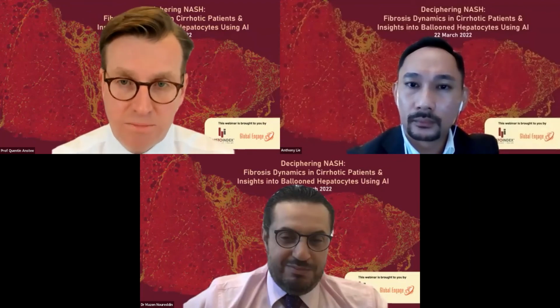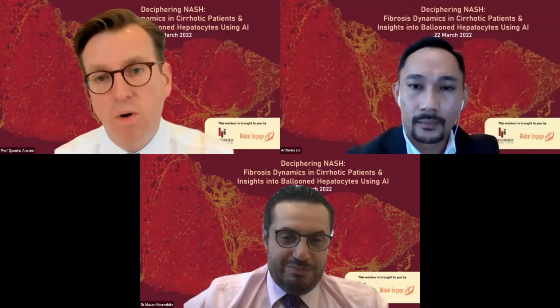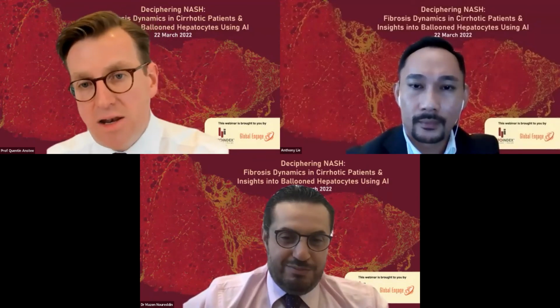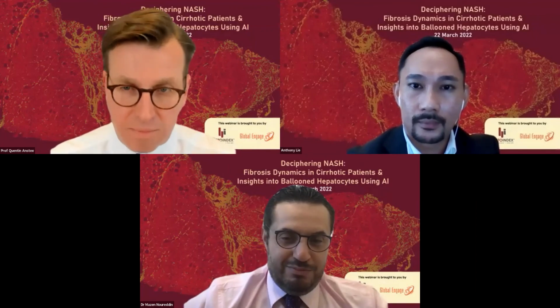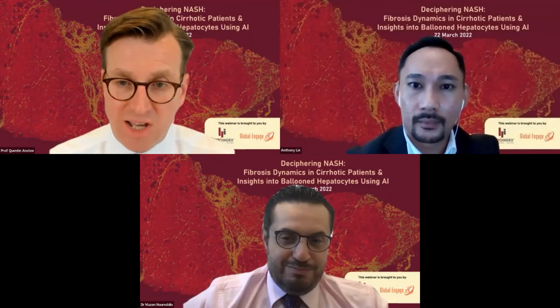So the pathologist examines a biopsy, confirms that it is the right disease, not autoimmune hepatitis, not viral hepatitis, and then the biopsy is passed over to the AI technology to give a quantitative readout. And that's another way that this could be used. I think there's a lot of discussion needed here, particularly with the regulators in terms of what they're ready to accept and what level of evidence we need to make those moves.